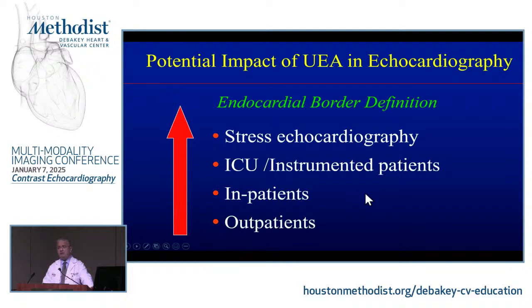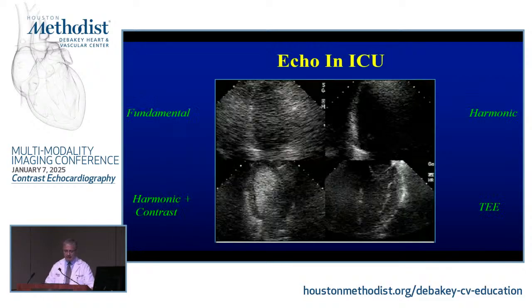And the reason for it: in the outpatient, people are less instrumented, they're ambulatory, you have less lung disease, etc. So inpatient, more issues, right? And the more issues you have with instrumentation and breathing.